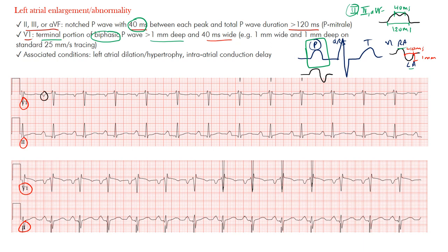Notice here are our P waves. If you look closely, you'll see they are at least one small box wide and one deep. Altogether, this patient did have left atrial enlargement. In lead II of this patient's tracing, there's some notching — look at this P wave, little notching there — about 40 milliseconds or one small box and just making about three small boxes wide. You can see that in other P waves as well.